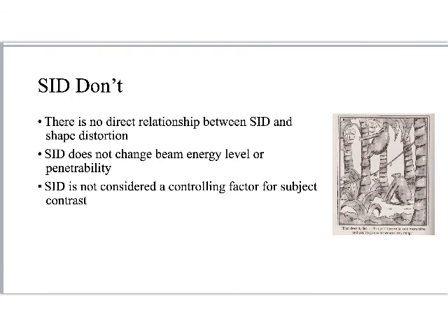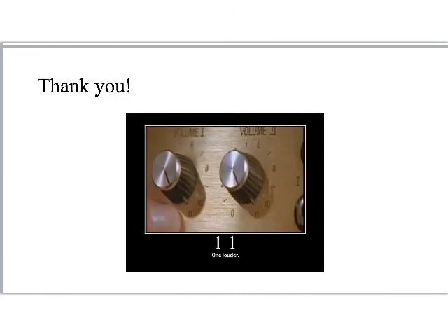So again, with the sound waves, it's not as though when I go to my room and I'm listening to my music, that all that music's still traveling at the speed of sound, right? All these X-rays are still traveling at the speed of light, so their penetrability has not changed. SID is not considered a controlling factor for subject contrast, so it's not a way that we're going to mess with our subject contrast at all. All right, and that's it.